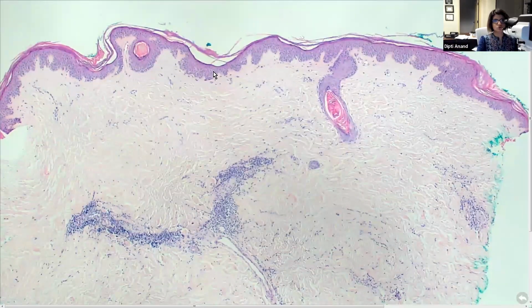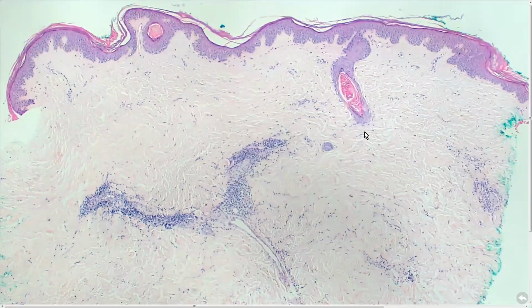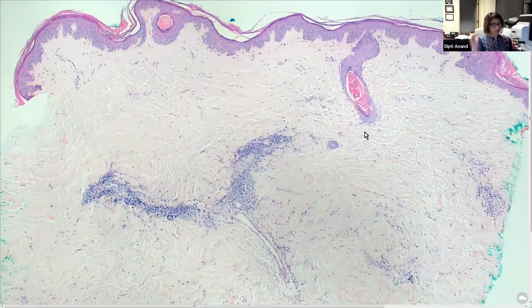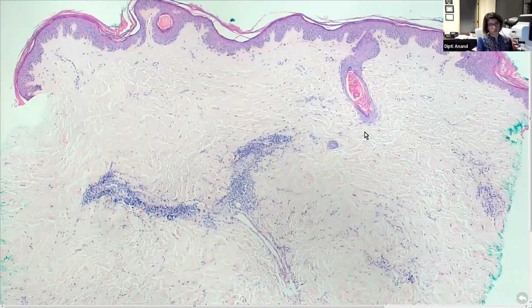And the epidermis shows no change. So that's important. In every case of morphea the epidermis should be normal? Because I thought sometimes it can look atrophic, or is that not? So the only time morphea has an involved epidermis is when there is overlying LSA. Okay. But otherwise, epidermis should not be involved in morphea.